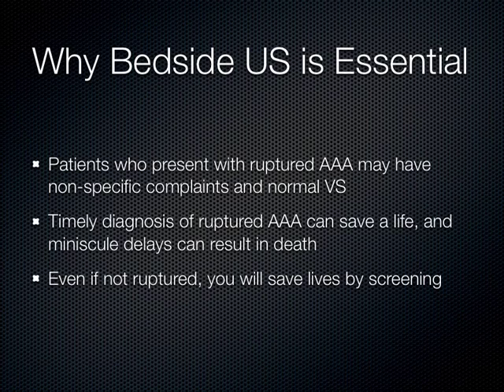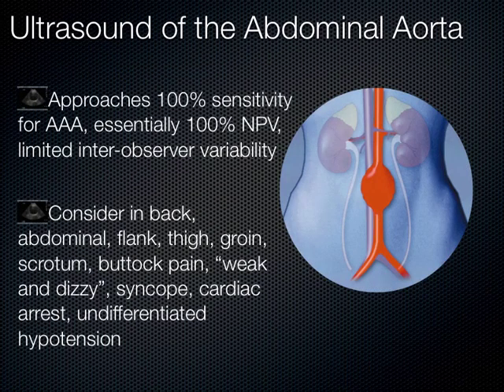So, as you move into next year, when you guys are doing physical exams with your ultrasound machines, you may uncover this in one of the patients you're seeing somewhere precepting. You never know, okay? Just keep that in mind, that Medicare reimburses any physician who wants to do a screening bedside ultrasound on any patient greater than age 55. Medicare will give you like $22. So think about that to pay your loans off.